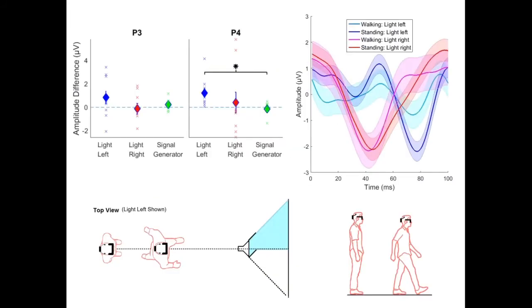So once we've established how many trials we need with the simulated data, we can look at the real SSVEPs. There are two ways in which we can analyze SSVEP results. One is a simple measure of amplitude, which is the equivalent of traditional power used in most EEG experiments. And the second is we can look at the waveform shape. So we can look at changes in the phase or the actual shape of the signal.